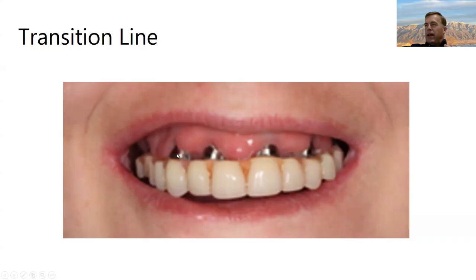Now, FP1s, on the other hand, have different challenges. And like this case, you can see with the gingival architecture, it wouldn't be awesome to convert even to an FP1 because the implants are kind of positioned between all the different sites. If we had one here, one here, one here, the shape is not too bad. You could do a little bit of alveoplasty here and potentially come up with a pretty decent FP1 case. And you're like, oh, I'll get the patient to smile. That's easy. Well, those of you who've done very many of these cases know that these poor patients, many of them are dental cripples, and they've been practicing for years to couch their smile.